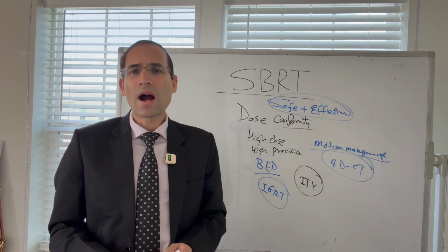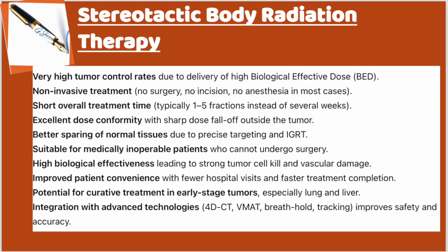So what are the advantages of SBRT? It is non-invasive. It's virtual surgery, highly precise, and has excellent tumor control history. But it is not without challenges. Remember that it has a lot of challenges also. It requires expertise, careful planning, and strict quality assurance. Therefore, it is costly.